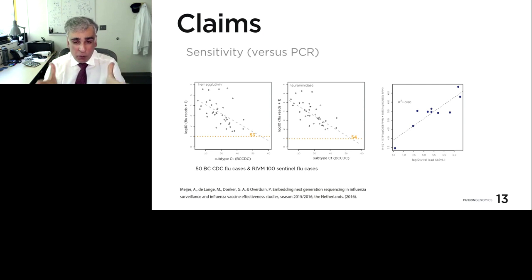Now, as you know, people, especially who come from the PCR world, know that a straight up CT of 53 or 54 does not exist, which is true. But what it means is that it is comparative to a nested PCR when a sample is sequenced at about 1.5 to 2 million reads per sample.